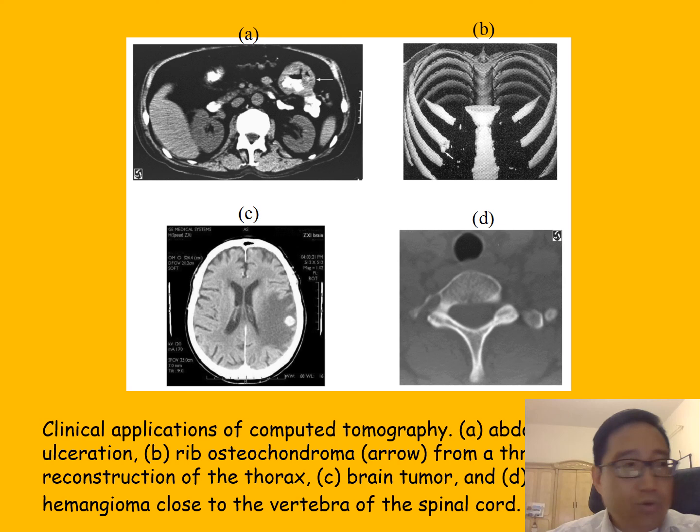X-ray to do mammography. These are low energy X-rays to detect the calcified knots in the breast for early detection of breast cancer. Anytime you have a bone problem or cartilage problem in your joint, you can take an X-ray. You can use X-ray to visualize GI tract problems, some solid tumors, and spine problems. We often use X-ray CT.